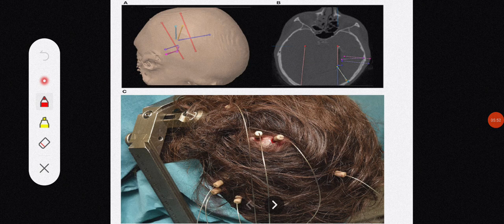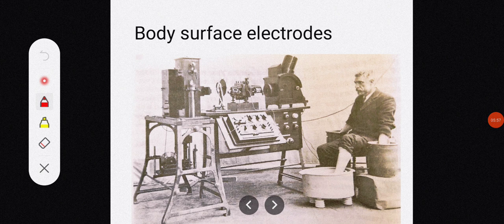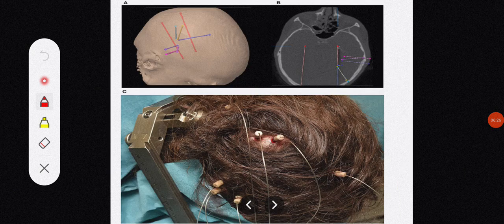As you can see in this diagram, when I was discussing the immersion electrodes, the patient has both arms as well as a leg placed into earthenware crocks, which are used as immersion rods. So it was found that it is advantageous to record the electrocardiogram from electrodes placed horizontally as well as vertically.